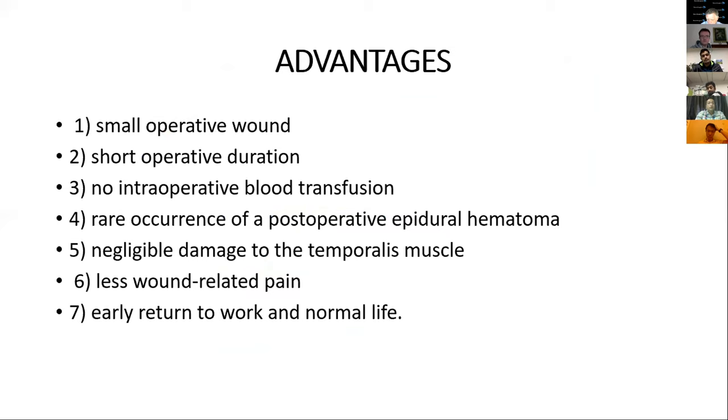Coming to the advantages of our approach, it leads to a small operative wound. The operative duration was also very short. Such a large tumor in a microsurgical approach with a large craniotomy usually requires 5 to 6 hours. We were able to complete the operation within 3 hours. There was no intraoperative blood transfusion. There was rare occurrence of postoperative epidural hematoma in this particular case because the craniotomy is small.